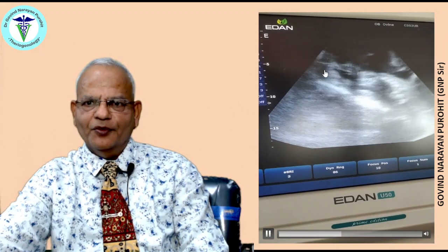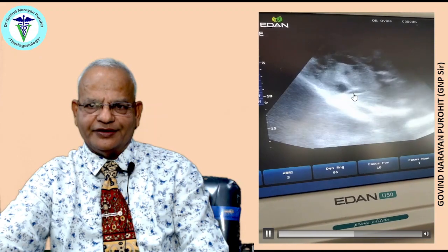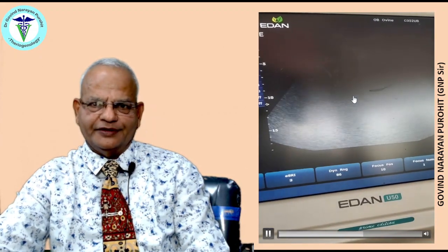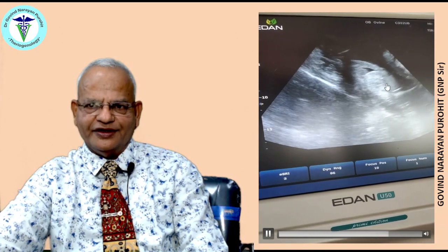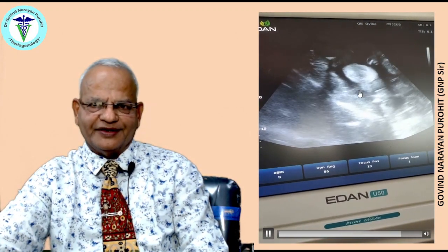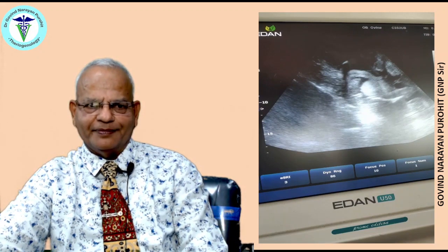This is the actual ultrasound being carried out on the same goat. You can see the fetal fluid — the anechoic fluids — the fetal bones, and the fetal heartbeat. You can see the fetal heartbeat and also the fetal movements. With practice you can visualize other structures of the fetus and the cotyledons. Even if you don't find other fetal structures, if you find the cotyledons and the anechoic fluid, you can very well confirm that the animal is pregnant.